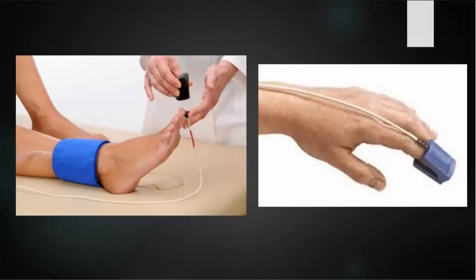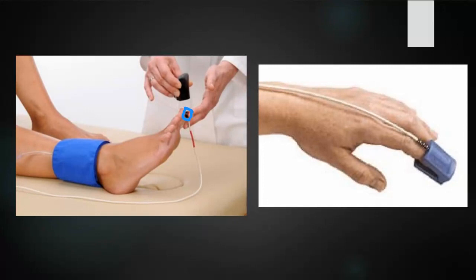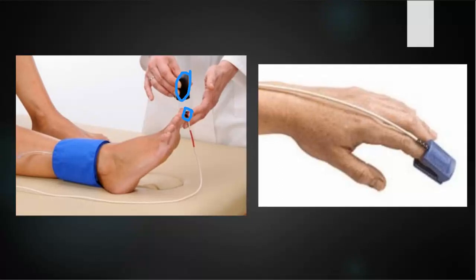This is our PPG sensor, this little guy right here, putting it right at that tip of the toe. And we'll have like a little cover. Usually, see how it's nice and dark? It's gonna go right over the toe to hold that in place. If you worked at low budget hospitals like myself, you are taping that sensor to the toe and you're covering it with the towel. Here we can again use this up in our fingers. If you've ever had your pulse ox done, very similar sort of technology.